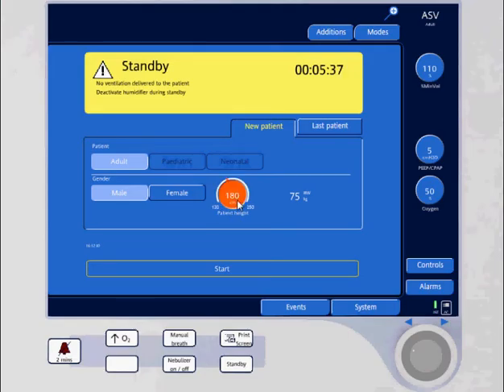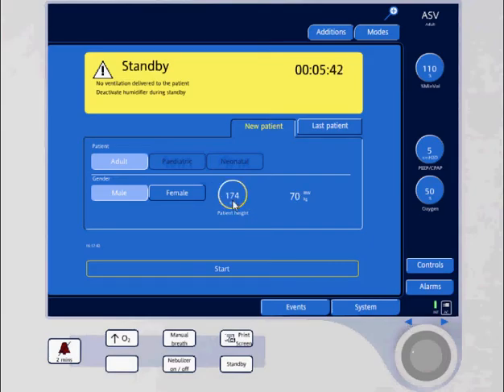I'm changing the height to 174 centimeters. This is a patient that's 5 foot 9 inches, and the ideal body weight is 70 kilograms.